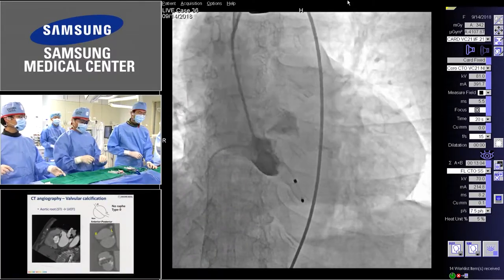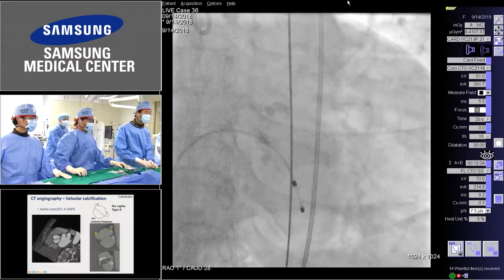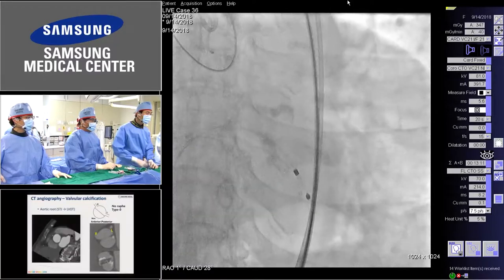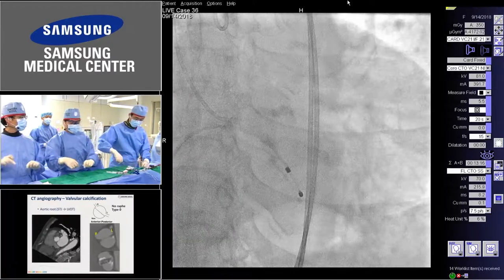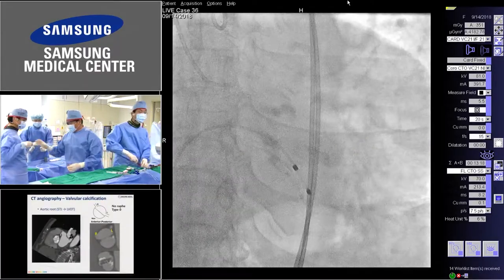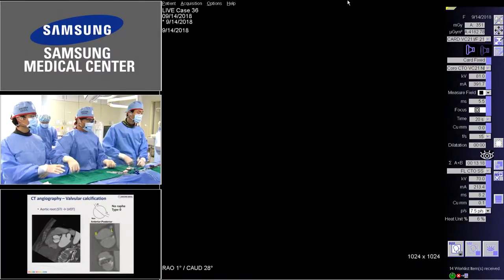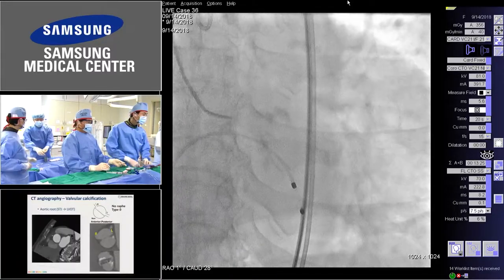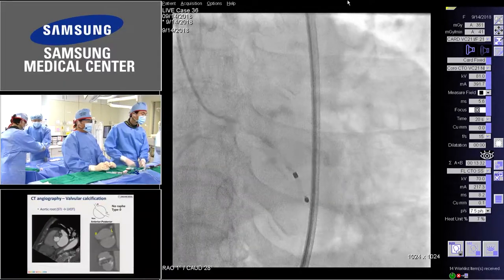That means if you use a Sapien or a CoreValve, whatever valve you're using, you have to implant high. So is that dependent on the severity of calcification, or regardless of the calcification? That's not so massive here, right? What type is it? Type 0? Yes, real bicuspid, no raphe, but calcification is not that severe in this patient. If the calcification was much more significant and dense, then the outcomes are not as good. In this patient you would have better results because of the lack of calcification.